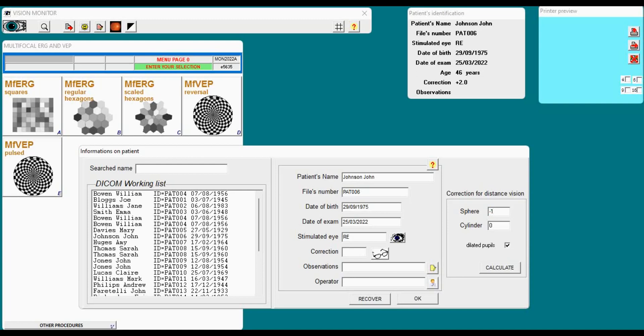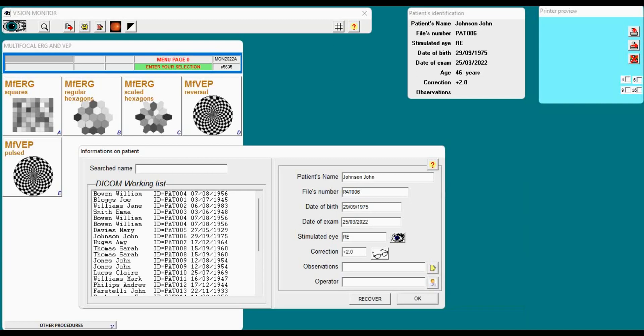I validate and automatically the software will calculate, taking into account the patient's age, what lens in the set of lenses provided with the instrument I can put on the patient.